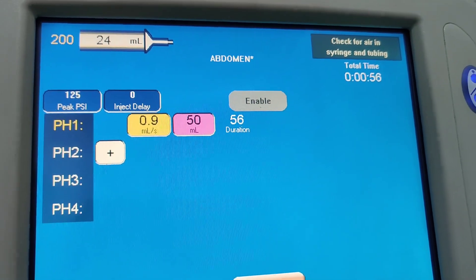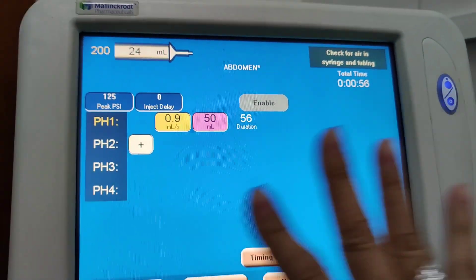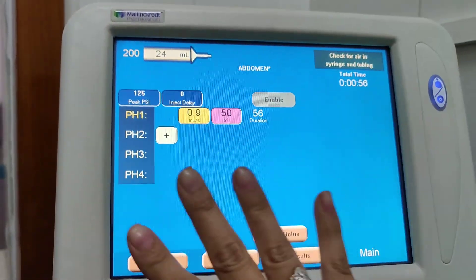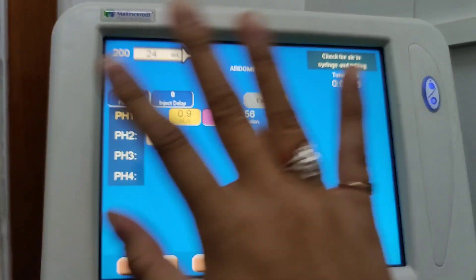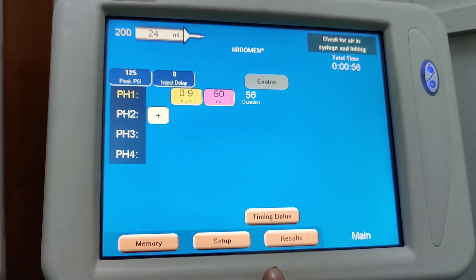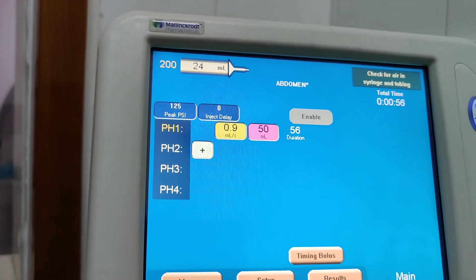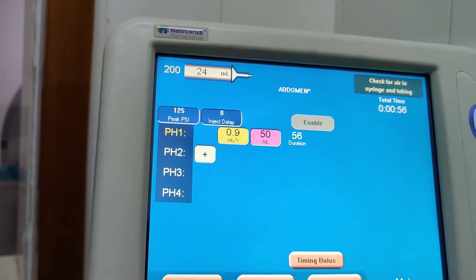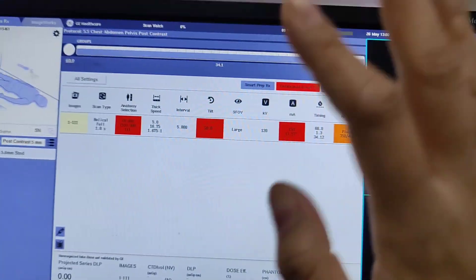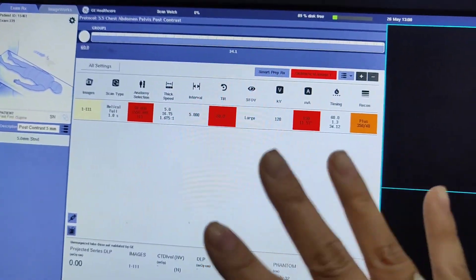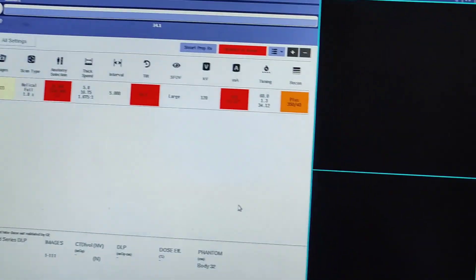We're going to go through a quick overview of this software program for contrast administration and how to incorporate it with the scans you have.